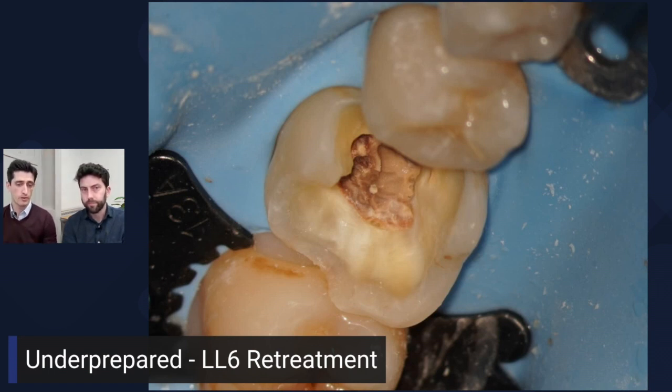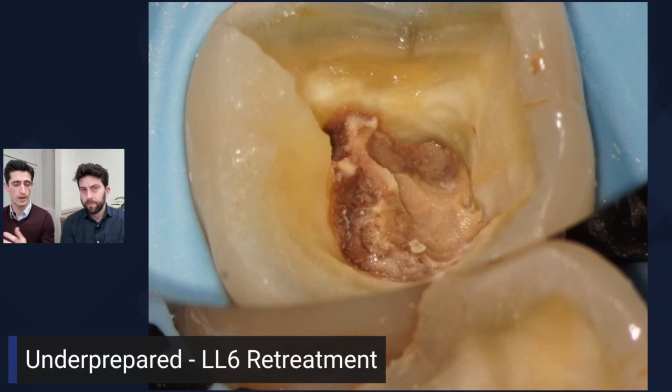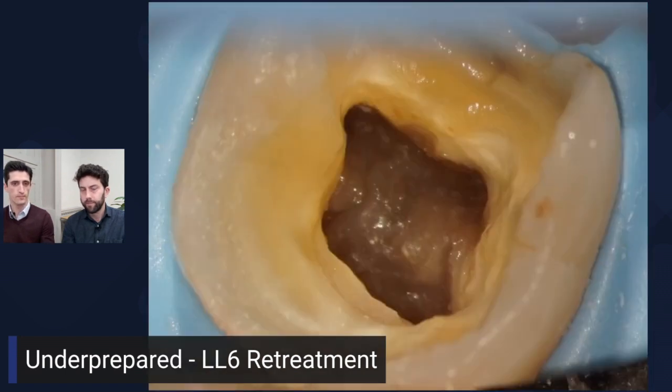Reducing the cusps avoids the risk of fracturing the tooth between appointments and makes life easier — you've got slightly flatter cusps for measuring and a shorter tooth. Looking at the paste root filling, it's probably Spad or Endomethasone — very outdated, old-school paste fillings. I remove this using a piezo scaler, specifically the number three cap tip from Acteon. I just blast it — it breaks it up, and it's also relatively conservative in that process. You can have water on and water off, which lets you dig a little and then clean straight away.